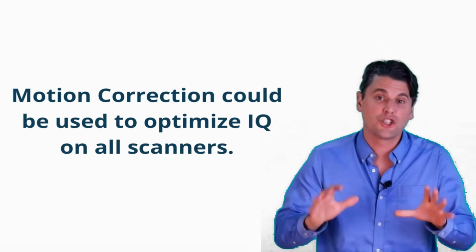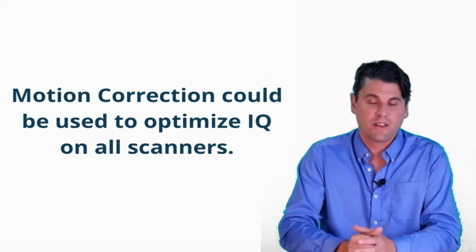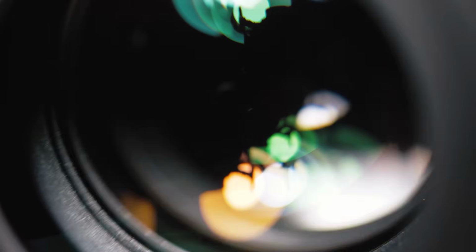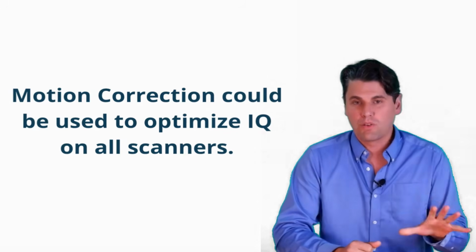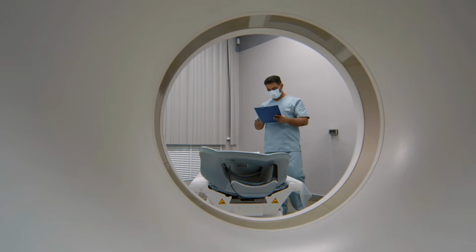We believe that motion correction should be used to optimize the image quality on all scanners. And just like how cameras have both a fast acquisition, then they also have software in order to help reduce the motion artifacts. Motion artifacts can be significantly mitigated in CT scanning as well.